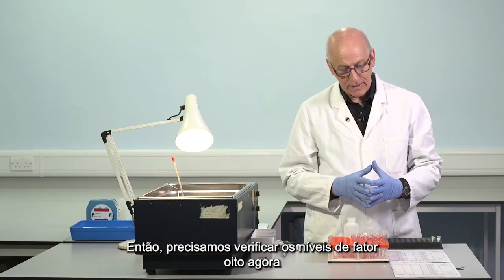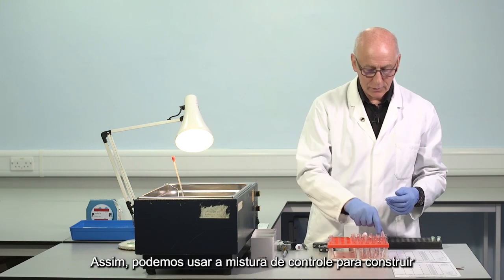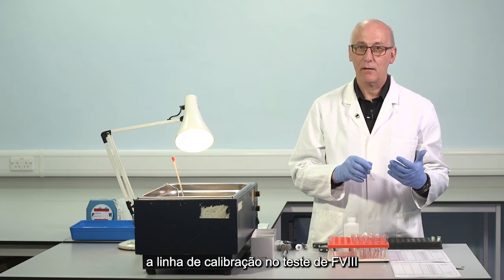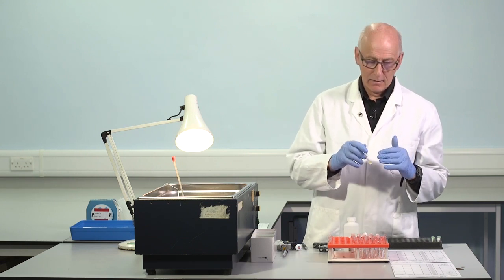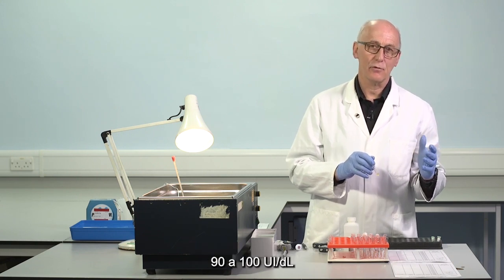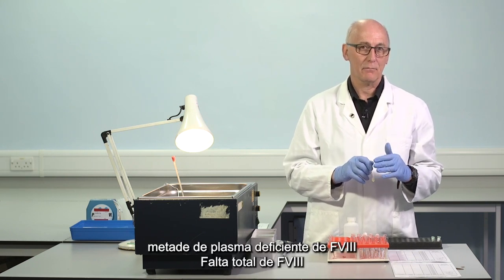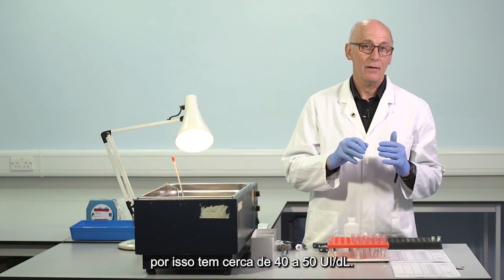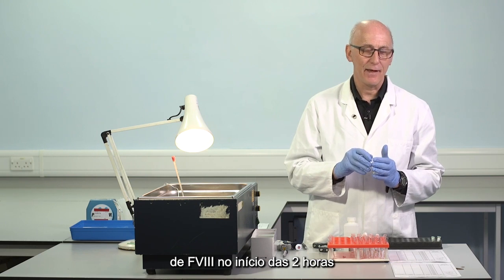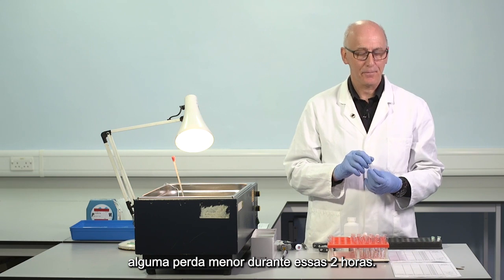So we need to check the levels of factor 8 now in each of the mixtures relative to the control mix. So we can use the control mix to construct a calibration line in the factor 8 assay. This is an equal mix. Half pooled normal, contains around 90 to 100 international units per deciliter. Half factor 8 deficient, completely lacks factor 8, so has around 40 to 50 international units per deciliter factor 8 at the beginning of the 2 hours, some minor loss during that 2 hours.